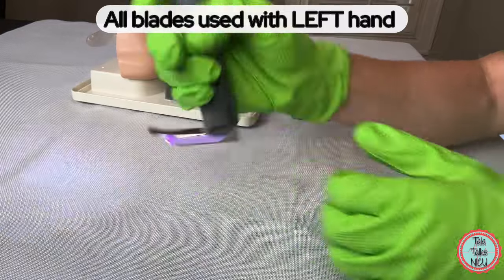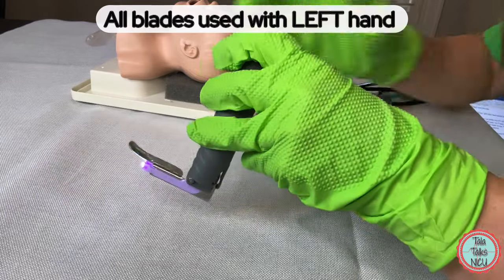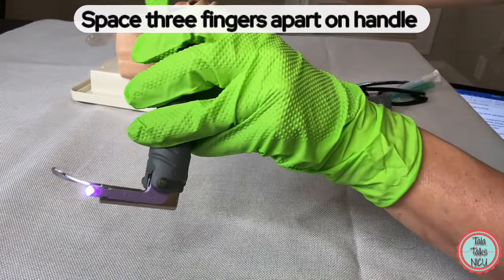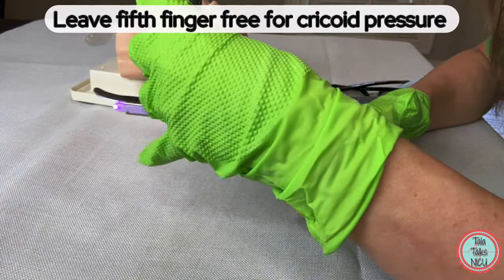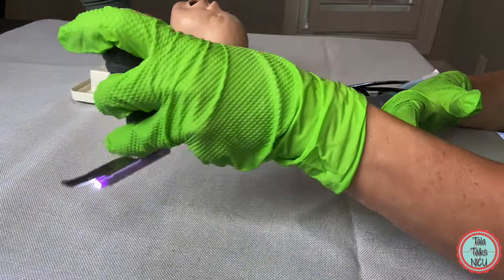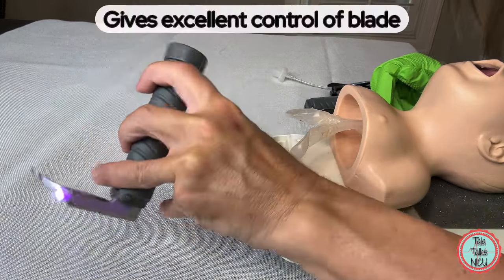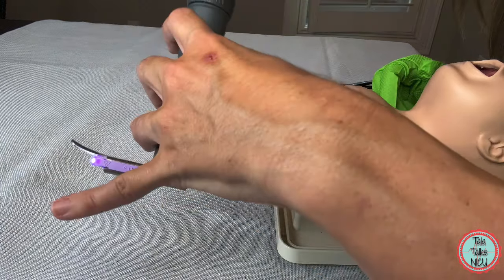Now let's grab the blade. Whether you're right-handed or left-handed, all blades are made to be held in the left hand — there are no right-handed blades. The best way to hold the blade is by using three fingers spaced out apart on the holder and then the thumb on the other side. That leaves your pinky finger able to apply cricoid pressure. Look at the way I'm holding this laryngoscope: one thumb on that side, three fingers spaced out — this gives you excellent control.